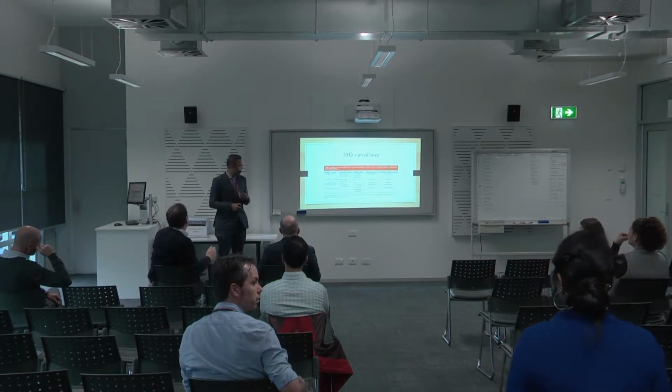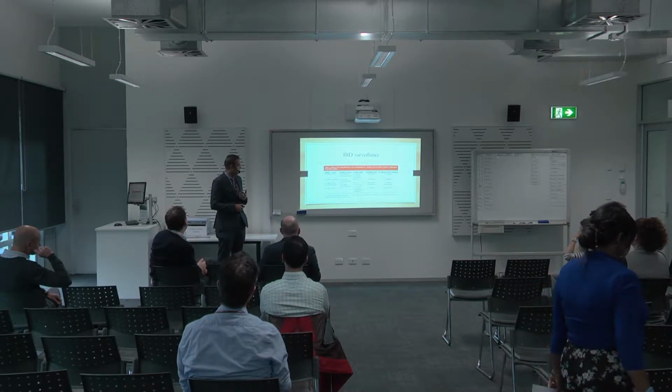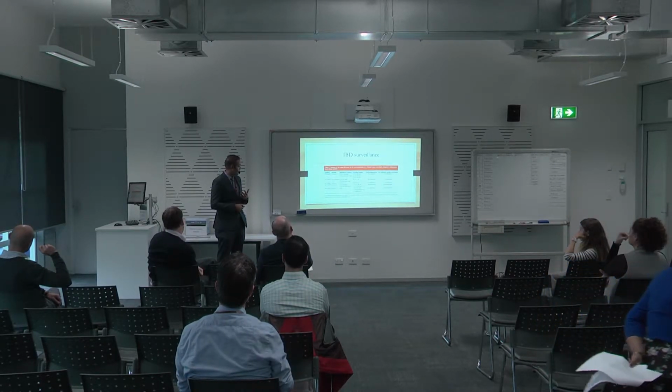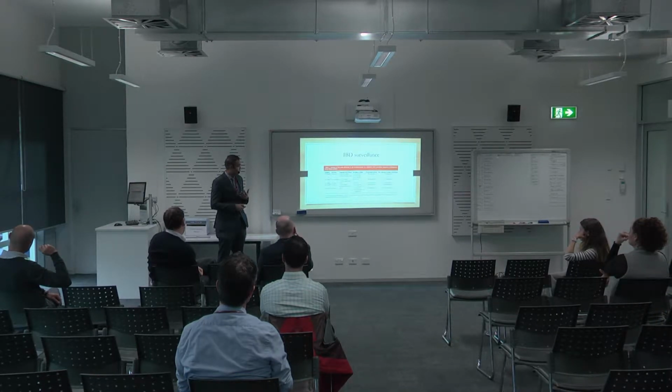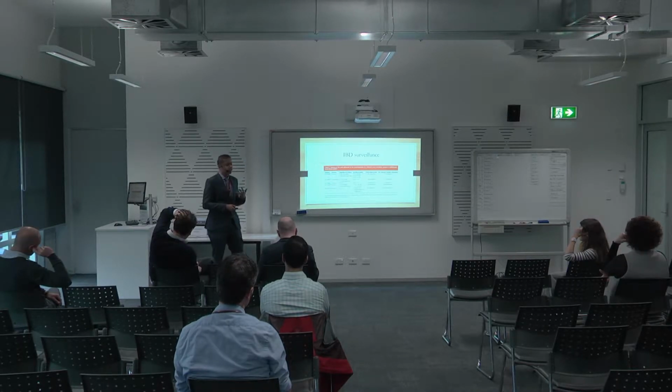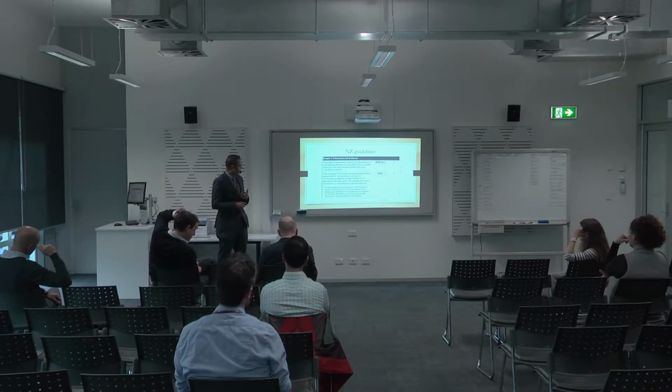Now, if you look worldwide at what's been happening, the guidelines prior to 2008 did not mention what type of technique to use. But if you look at the ECCO guidelines, which is the Crohn's and Colitis group in Europe, or the British Society of Gastroenterology, they have recommended chromoendoscopy, and subsequently American guidelines have suggested that as well, and a few other nations as well. Well, how are we doing?